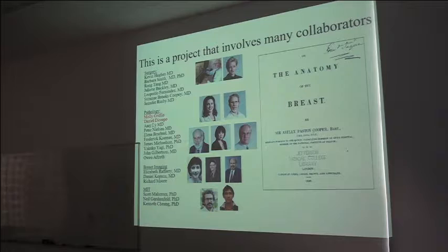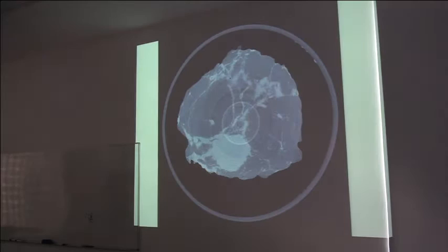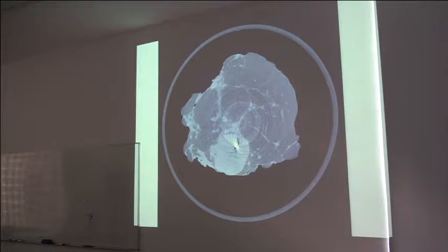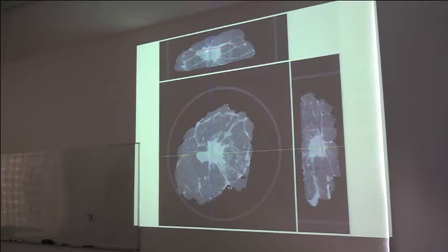This was literally the very first patient. And there you can see the breast cancer. And there you can see the specimen. And as you go through it, bingo, it touches the edge. In fact, this patient was found by the pathologist to be margin positive a week later, but we knew it in 10 minutes.